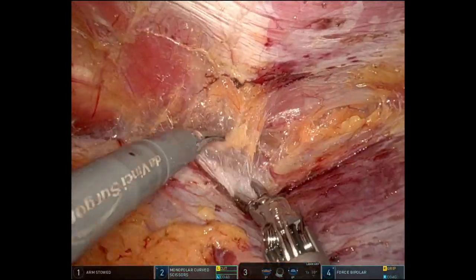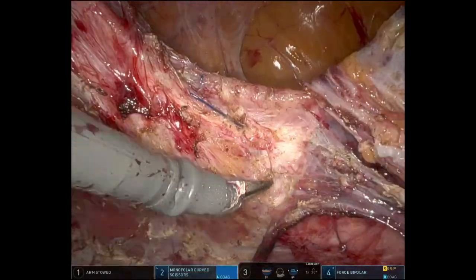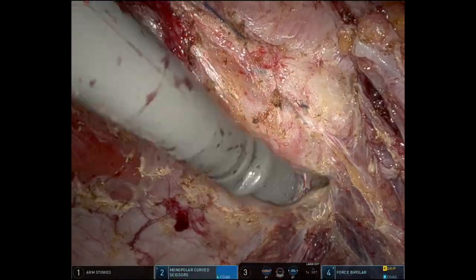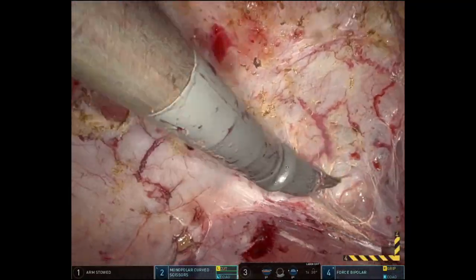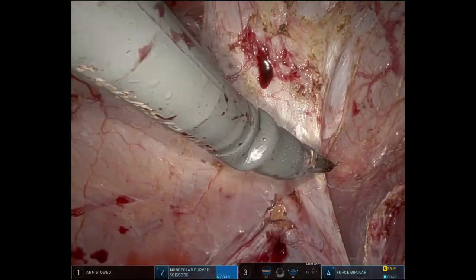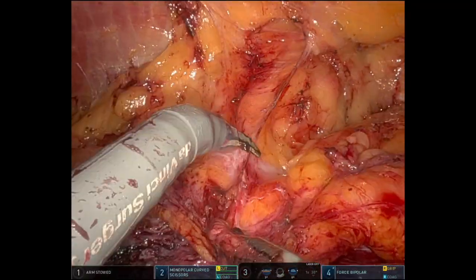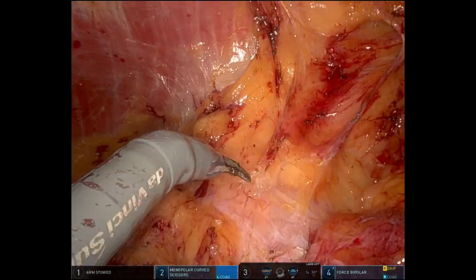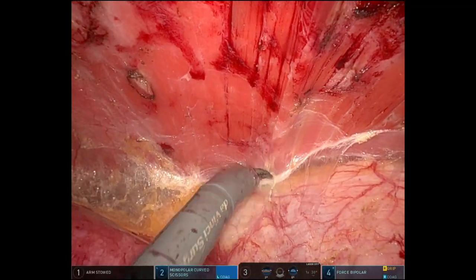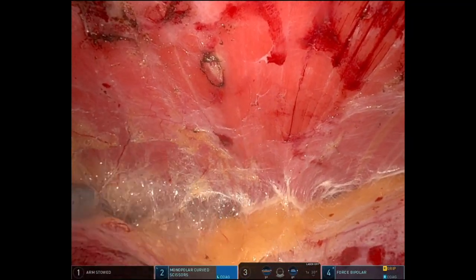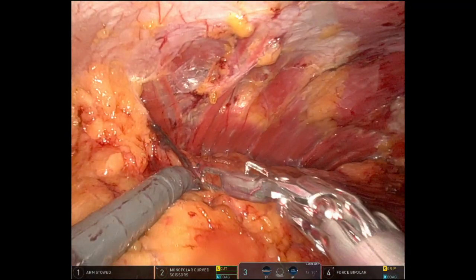Once I developed that space in the virgin planes, I'm moving towards the hernia defect itself, where it's scarred. She had an exploratory laparotomy before for a sigmoid resection with colostomy and reversal. Developing the preperitoneal space is quite tedious at the posterior rectus sheath, separating the peritoneum away — but if you stay above the transversalis fascial layer, you'll be fine. I dissect that space, rotating the hernial sac medially all the way into the pelvis. My endpoint of lateral dissection is once I see the retroperitoneal fat — then I stop, knowing the visceral sac is fully rotated medially, giving us enough peritoneal coverage.